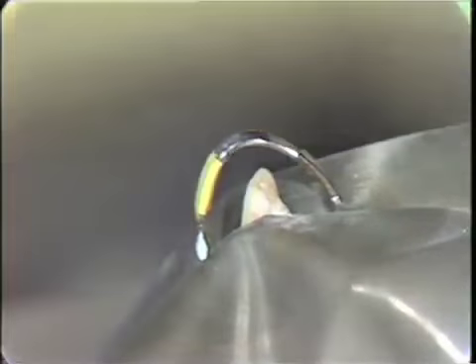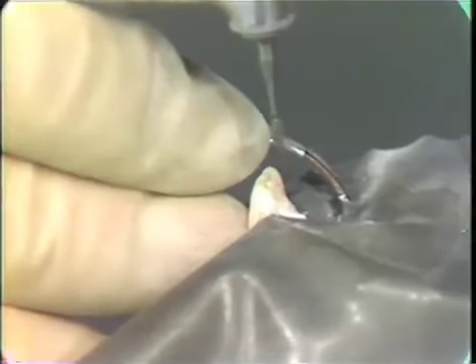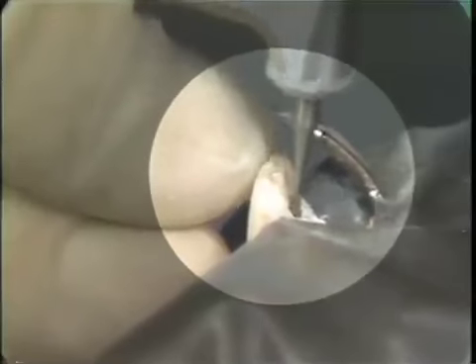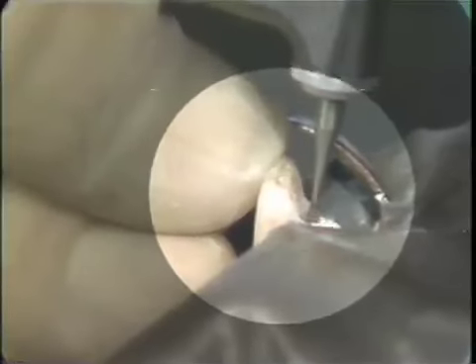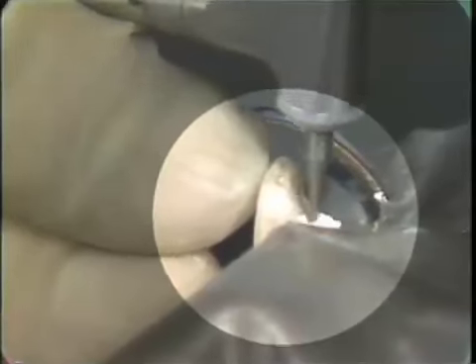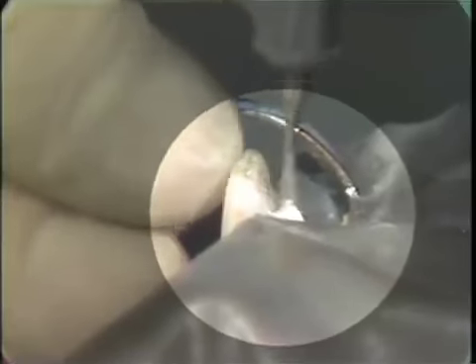Now I want to change burrs, put in my surgical length flame-shaped burr for the final smoothing and flaring of the preparation. This goes down into the pulp chamber, and slowly along all of the walls I refine the final outline form. I smooth. It's a very slow cutting instrument, so you can smooth very easily, making sure that you can get down into the pulp chamber without gouging the tooth.